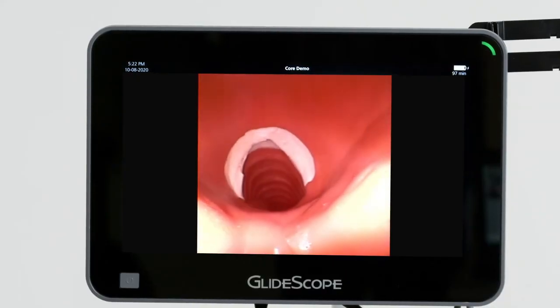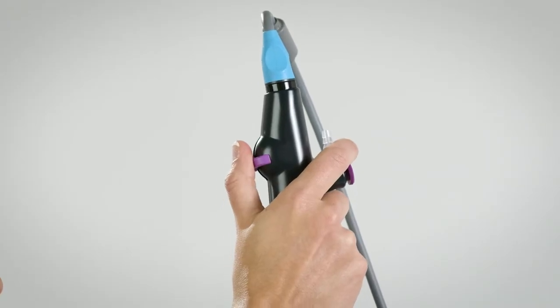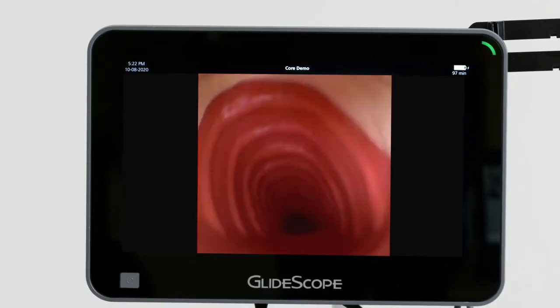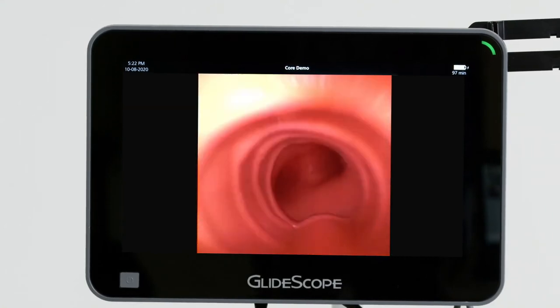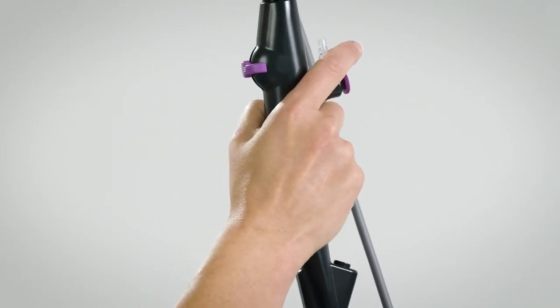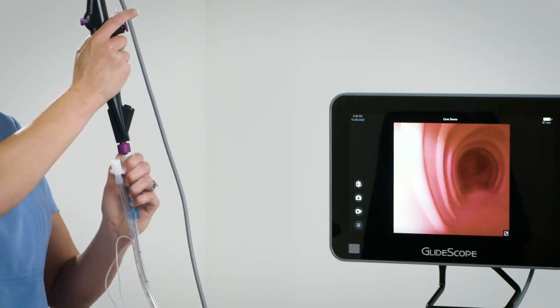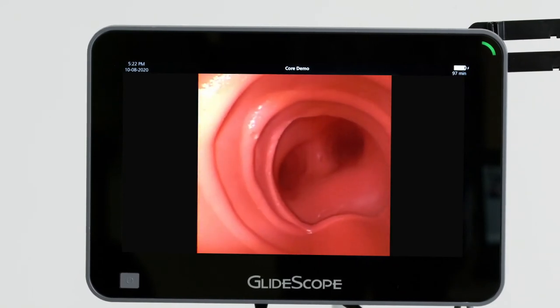Now I'm going to use my B-Flex scope to visualize the cords and I'm going to use my lever to flex up the distal tip of the scope and enter into the trachea. Now I'm advancing my scope down the trachea. I'm going to remove my thumb from the lever to maintain the scope in neutral position before I offload the scope from the tube retainer and advance it slowly into the patient's trachea.